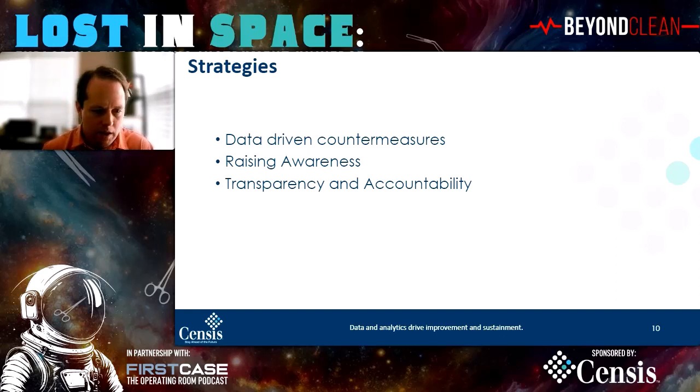So collecting accurate data about the problem, what happened, when did it happen, all the relevant context, being able to do that in an automated way, and then put that into an analytics platform to analyze it, gives you the ability to have those data-driven countermeasures, right? So you can say, okay, here's our current missing instrument rate. Here's the OR room that has the highest missing instrument rate. Here are the top 3 instruments that go missing from that room. Let's go do an in-service and raise awareness about these things.